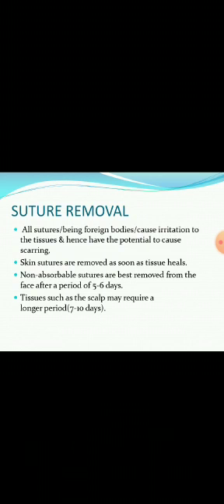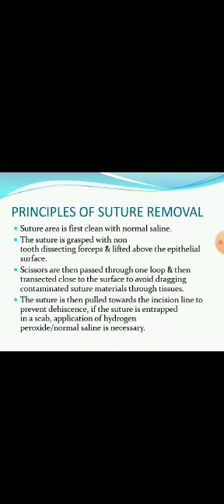All sutures and foreign bodies cause irritation to the tissues and hence have the potential to cause scar. Skin sutures are removed as soon as the tissue heals. Non-absorbable sutures are best removed from the face after a period of 5 to 6 days. Tissues such as the scalp may require longer periods, such as 7 to 10 days.